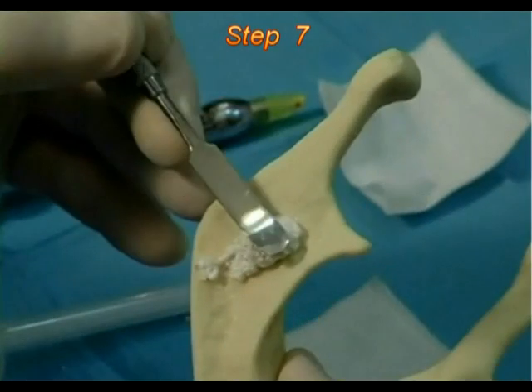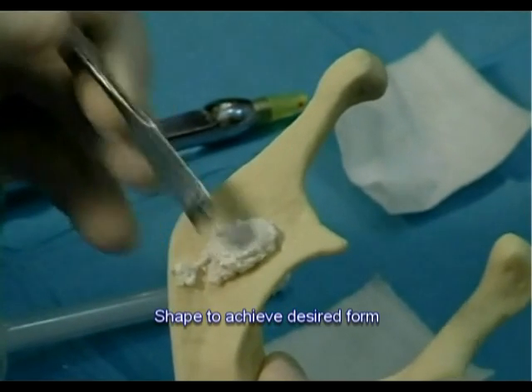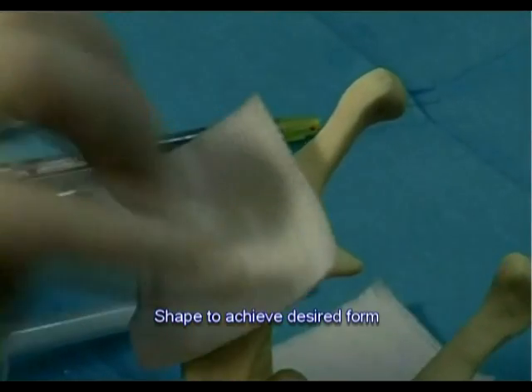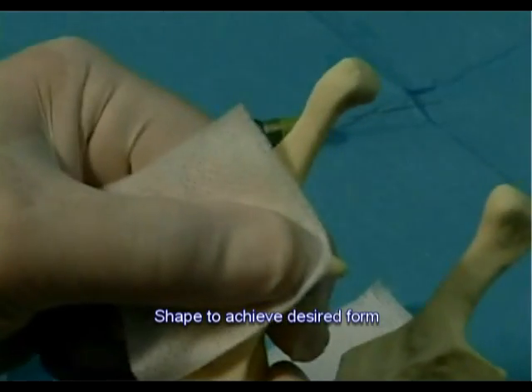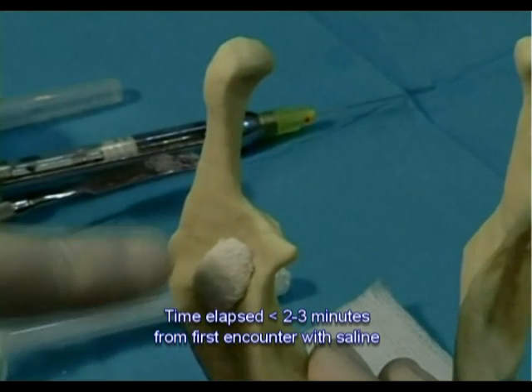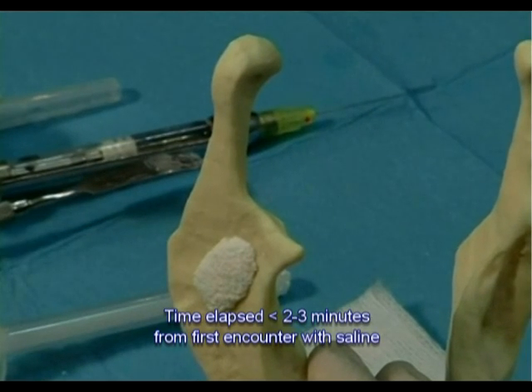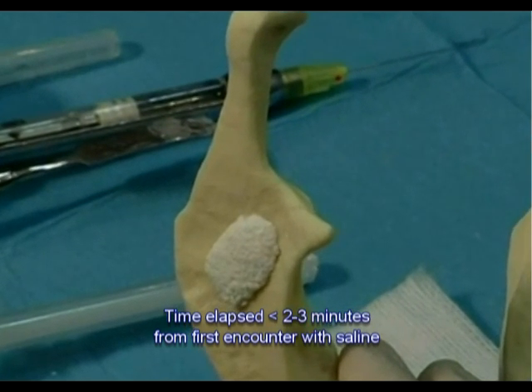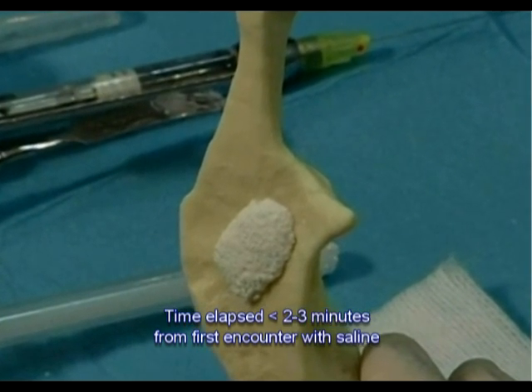Step 7: Shape as necessary to achieve the desired form. Apply a dry gauze pad for 3 to 5 seconds and condense the composite graft. Make sure the time elapsed since the material encountered saline did not exceed 2 to 3 minutes.